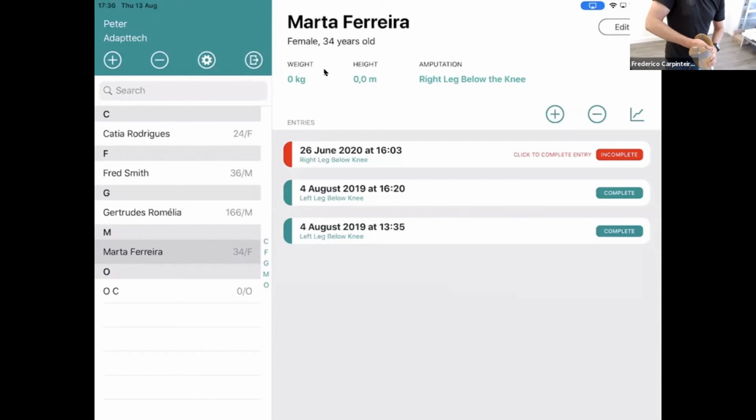As I said, I'm using 4 strips in this, and I'm going to place the socket with the strips inside the scanner. So place the socket inside the scanner, you close the gripper, and you have it in the proper position. Then close the door, and we move on to the app.